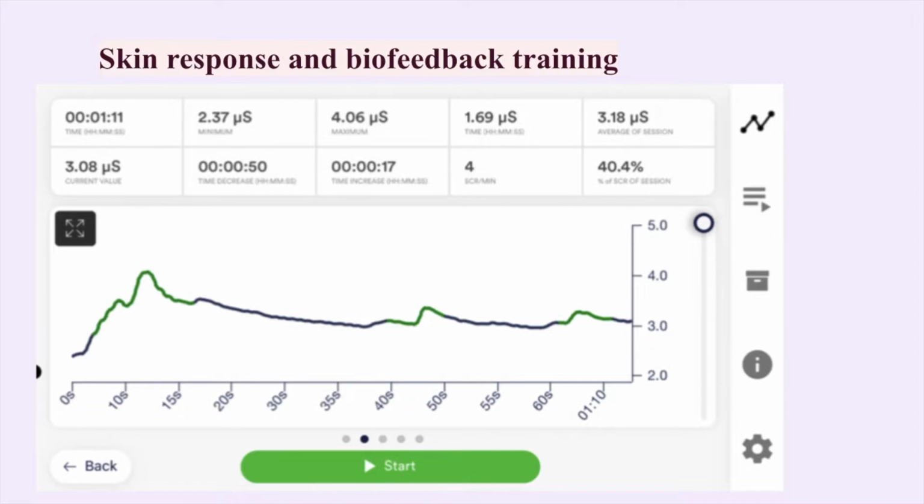Have a look at the following example of a measurement to see how insightful the results are. It can detect incremental differences in your skin response or the sweat gland activity. Measurements are done by placing two electrodes on two fingertips of the same hand. The dark-colored lower side of the electrode should be in good skin contact.